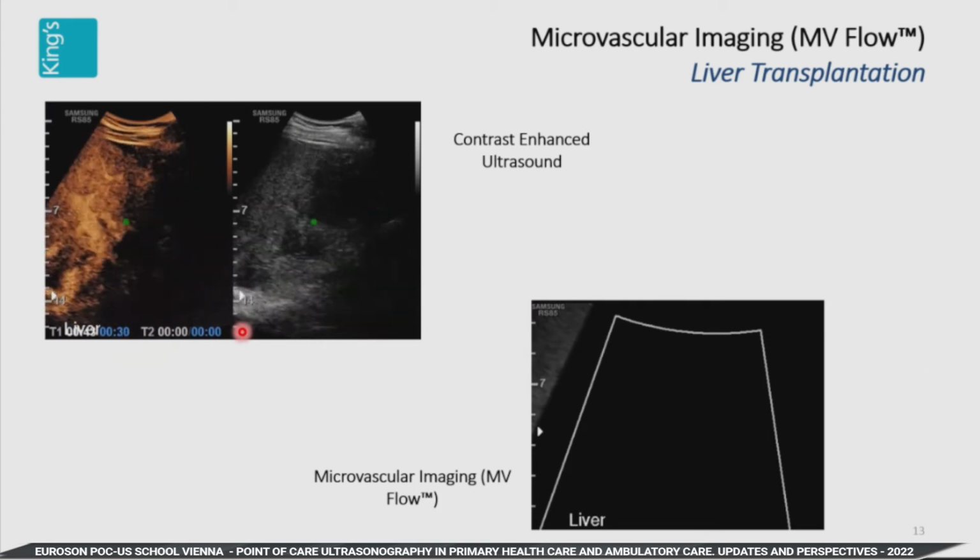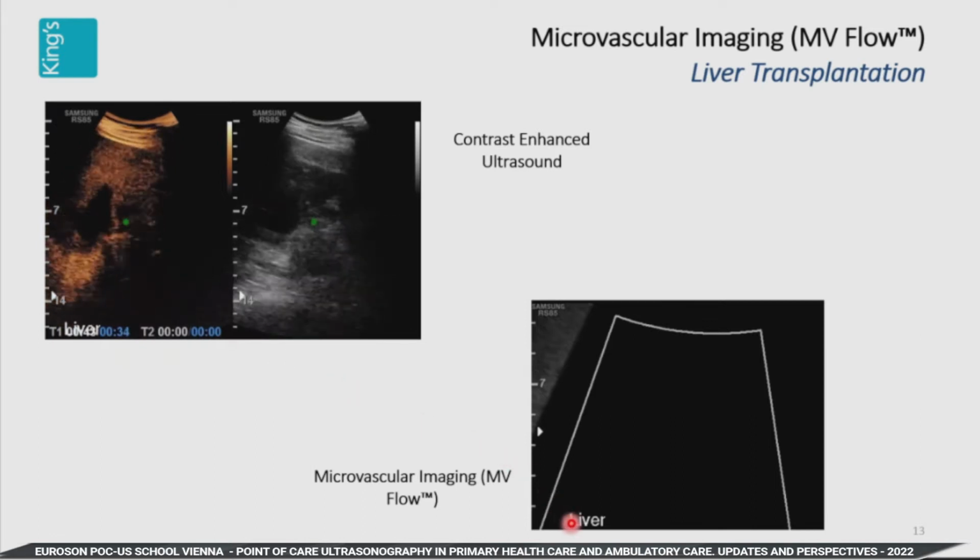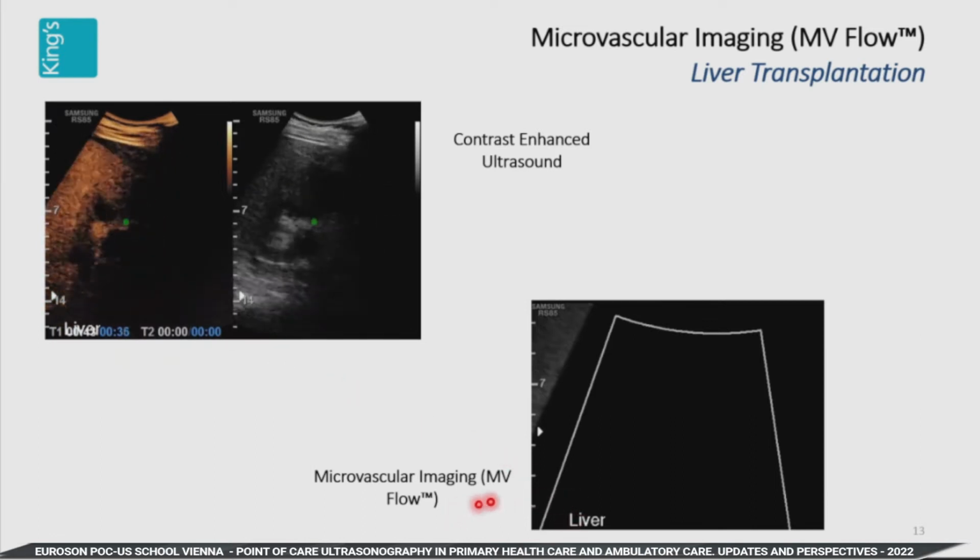You can do this at the bedside of the patient in the intensive care unit. There's no need to bring them down for other imaging. But microvascular imaging does this just as well.